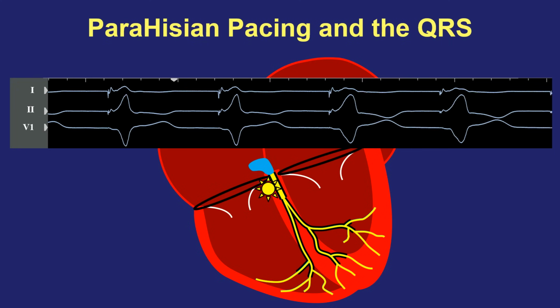Here are 4 ventricular paced beats, and you can see that the first 2 beats are skinnier and the latter 2 beats are wider, and we're pacing from exactly the same location the entire time. And that tells us that in those first 2 beats, we captured the His bundle in addition to ventricular tissue, and the third and the fourth beats, we captured only ventricular tissue.